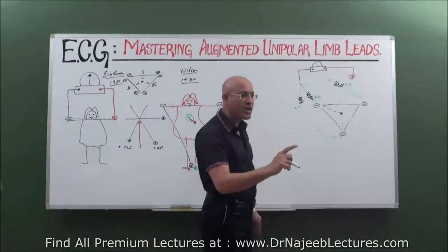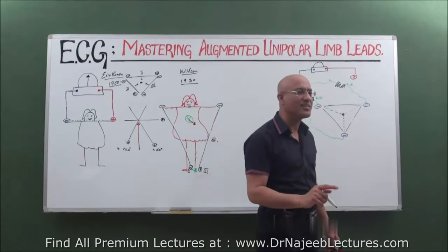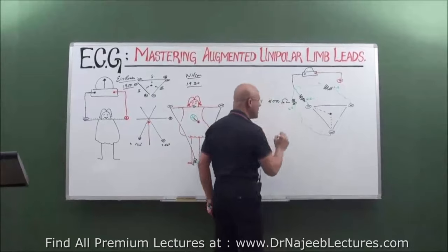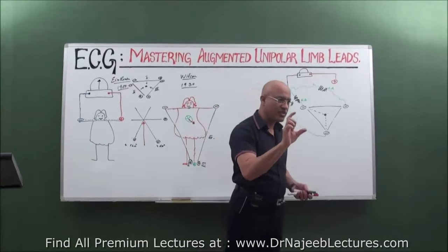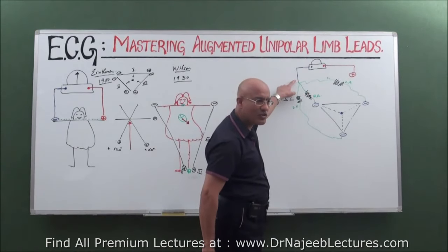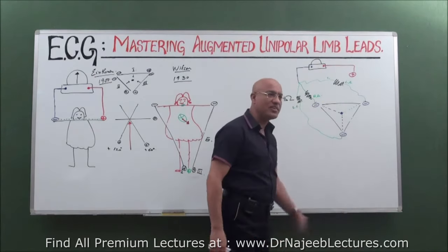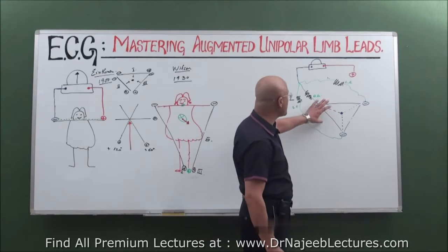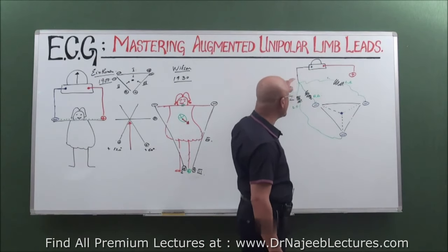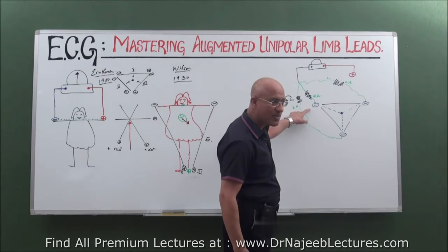That is why in unipolar leads there are resistors put, which are not put in the bipolar leads. So 5,000 ohm, right? Anyway, they put strong resistors. When they put the strong resistance, they achieved almost zero here. You get it? Yes. Now you are clear? Yes. So this is what Mr. Wilson did. Once he was able to make the negative terminal, he converted it into an indifferent terminal. It is no more really very negative.